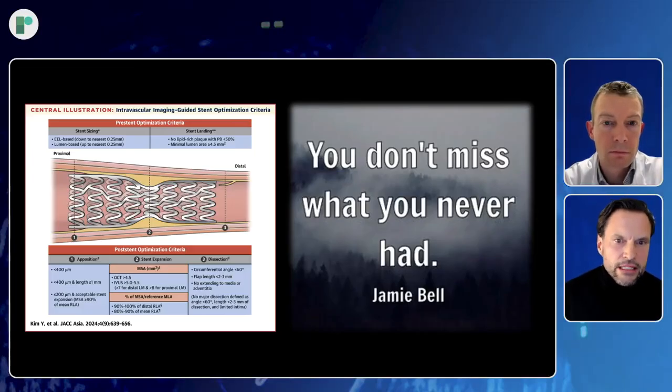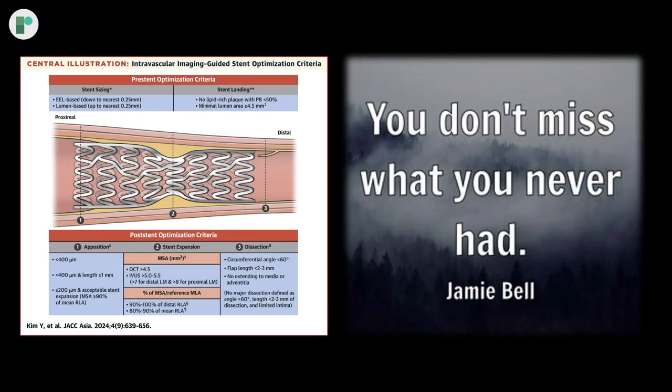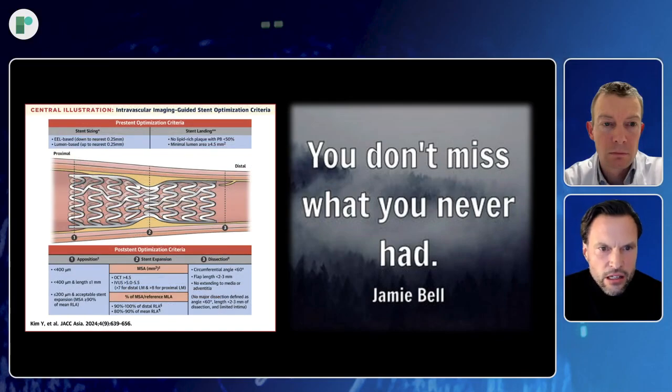The problem with intravascular imaging is that if you don't use it, you normally don't see what you have missed in your patients, and at the end you don't miss what you never see. So if you don't know it, then you don't miss it, and if your patient leaves the table untreated because you say angiographically this was not a significant stenosis, like in the case I just showed you, the patient will just come back a few months later with myocardial infarction.